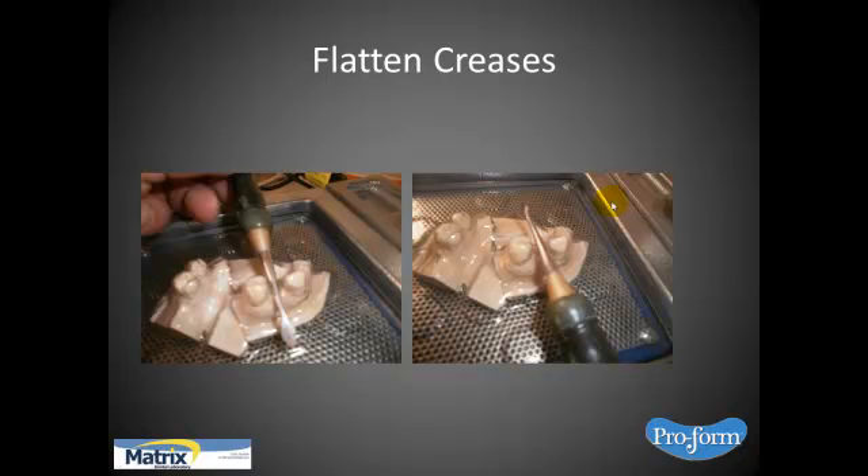While it's vacuum forming, it's critical that you flatten the creases. In many cases where you have abutments with an edentulous area between them, you're going to get a little crease that stands up. While the material's hot and vacuum forming, I take a rounded instrument and push it down, because I don't want a crease — I want it adapted at the interproximals as well. Be ready to flatten and help it form, taking out the crease, because you want a nice coping. You'll be trimming away all the excess and leaving just the form that covers the tooth.